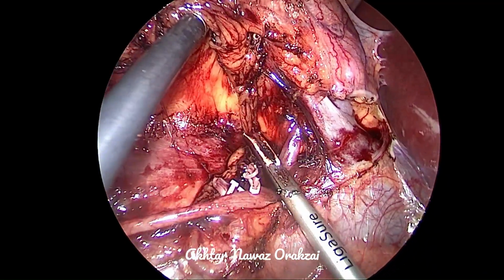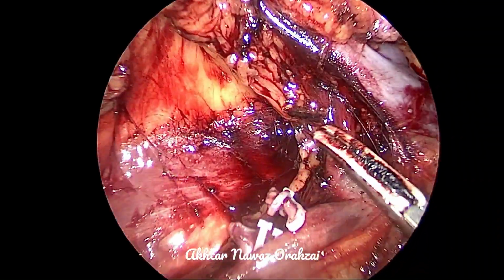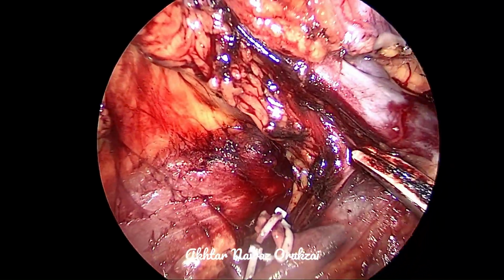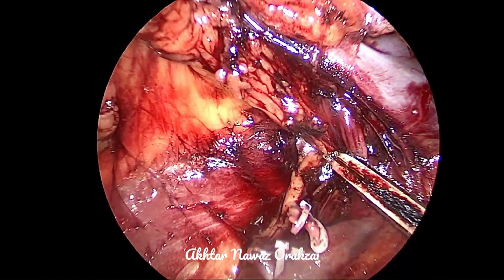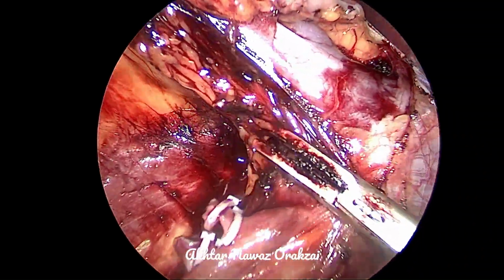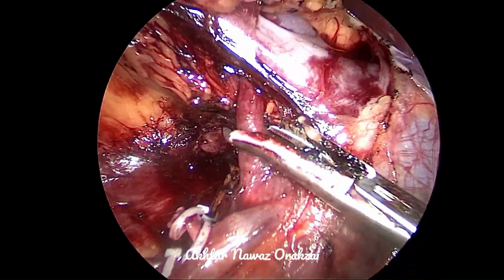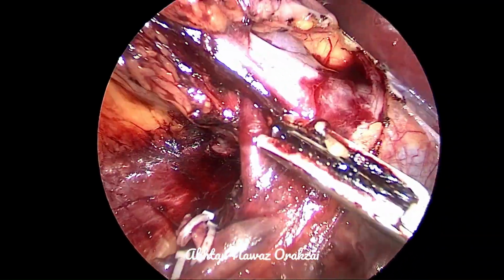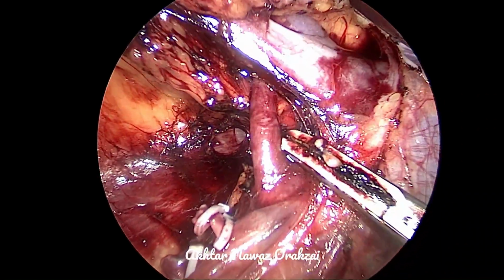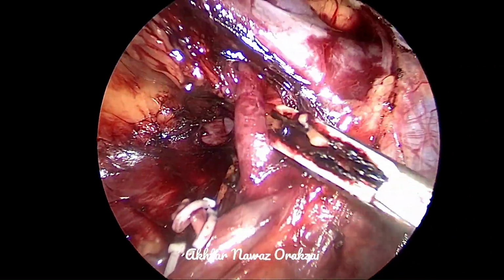We were happy that a big artery has been clipped and divided, so almost 60% of the kidney became ischemic. Here you can see the artery pulsating behind this accessory vein. However, we are still not able to identify the artery, so we decided to dissect around this vein, and maybe we have to clip and divide this vein as well in order to reach the artery. So the artery is, as you can see, at the tip of the ligation here.